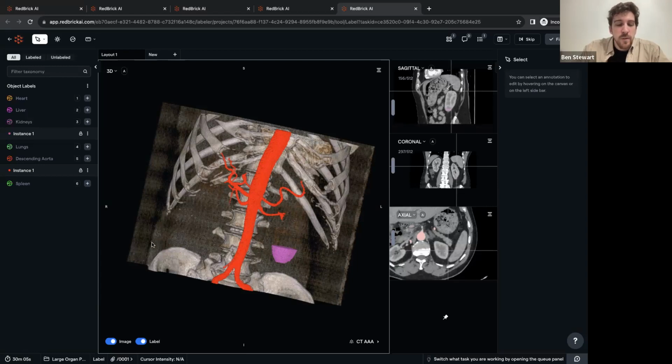Enhancing and non-enhancing part of the demo. Yeah, sure. This is maybe a question that I would like to dig into offline, but largely speaking, when you say differentiate, we offer several ways of doing that. It could be for individual object labels. It could be metadata for an object label. That could be one way to differentiate between the edema, the tumor, the enhancing and non-enhancing part.